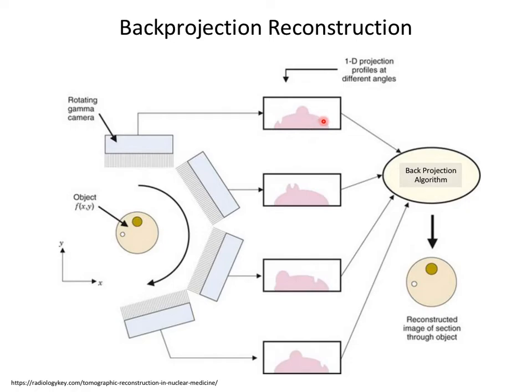What I can do is take these functions and stack them as a function of theta. Theta encodes each one of these. The difference between each one of these is that theta is changing. So let's take this brightness and stack it as a function of theta. We'll click through different thetas and stack that function.